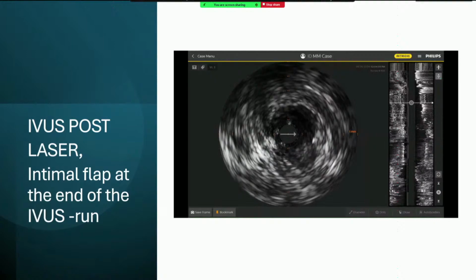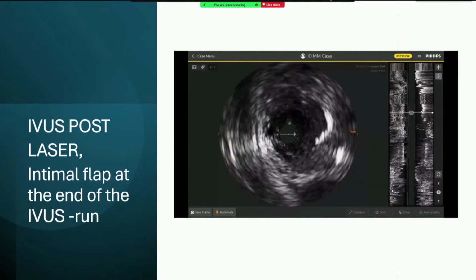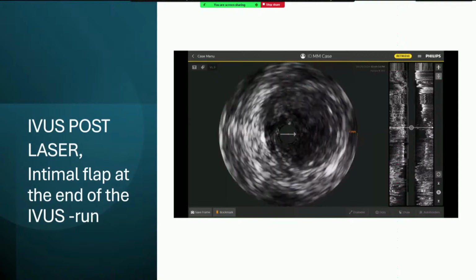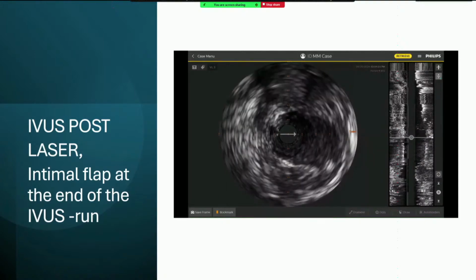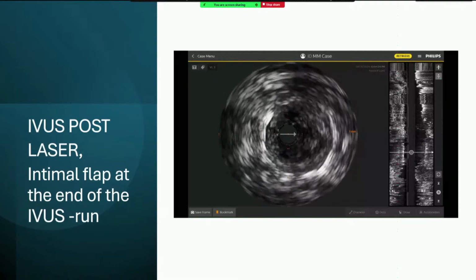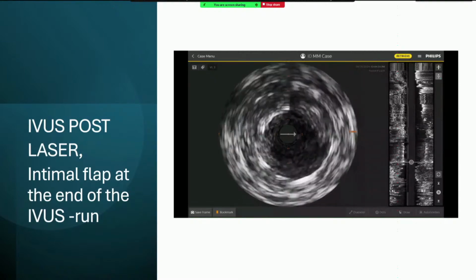So you can see the open vessel. There's already some pulsation to be seen. So we're in the below-the-knee vessel and still some thrombotic material is seen here, especially down below. Now we are in the stent, which is opened up, but there's still some thrombotic material.